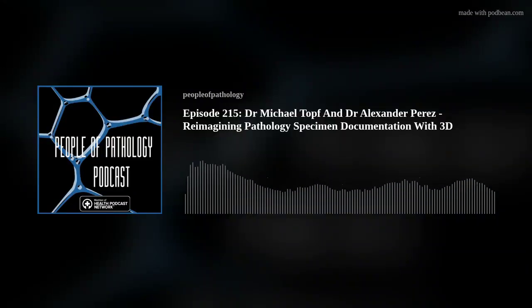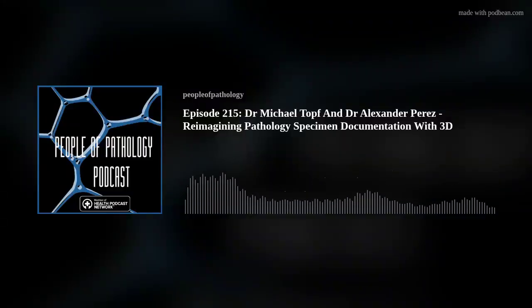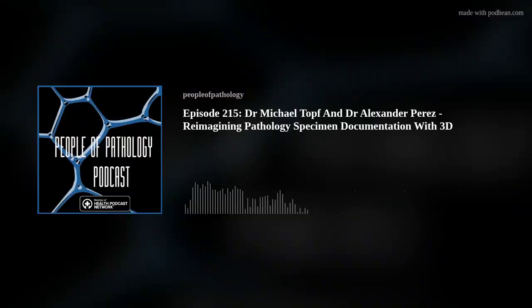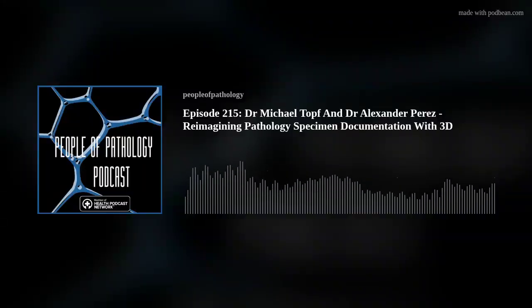All right. So we talked about the advantages of this scanning and the things you can do with it. I wonder though, getting this up and running, were there any particular challenges that you had to overcome to do it? Well, the big issue up front was when you tell someone, hey, we're trying to go for a 20-minute turnaround on a frozen section, we're going to add 8 to 10 minutes into that.